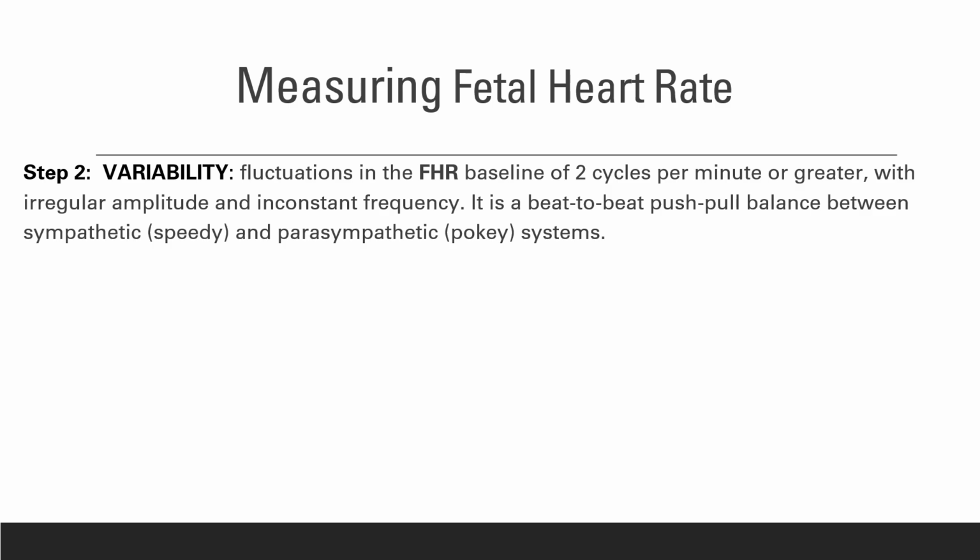Accelerations is the third step. You need to determine if there are any positive or negative accelerations. An acceleration is an increase of the fetal heart rate from the baseline to at least 15 beats above the baseline for at least 15 seconds long. And this is for babies that are 32 weeks gestation or above.